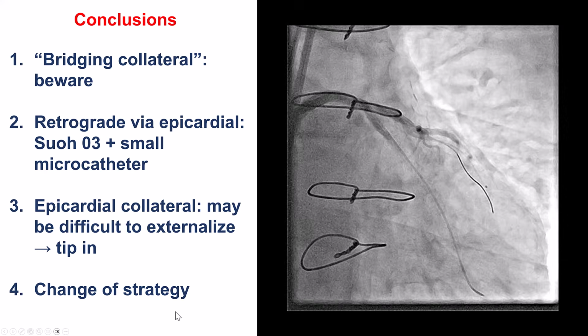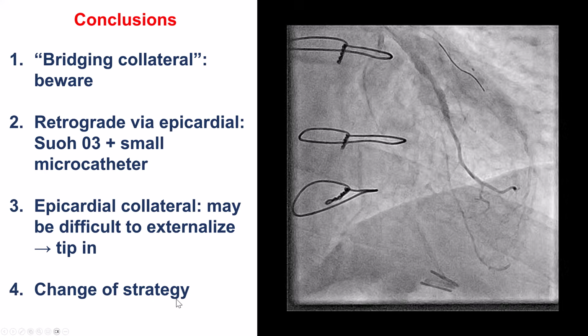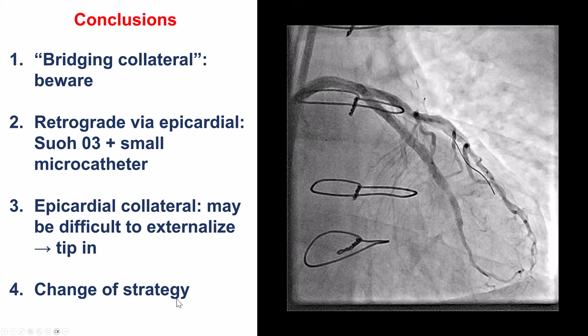And finally, like many cases, when one strategy does not work, it's always important to promptly change to another strategy that can be more successful.